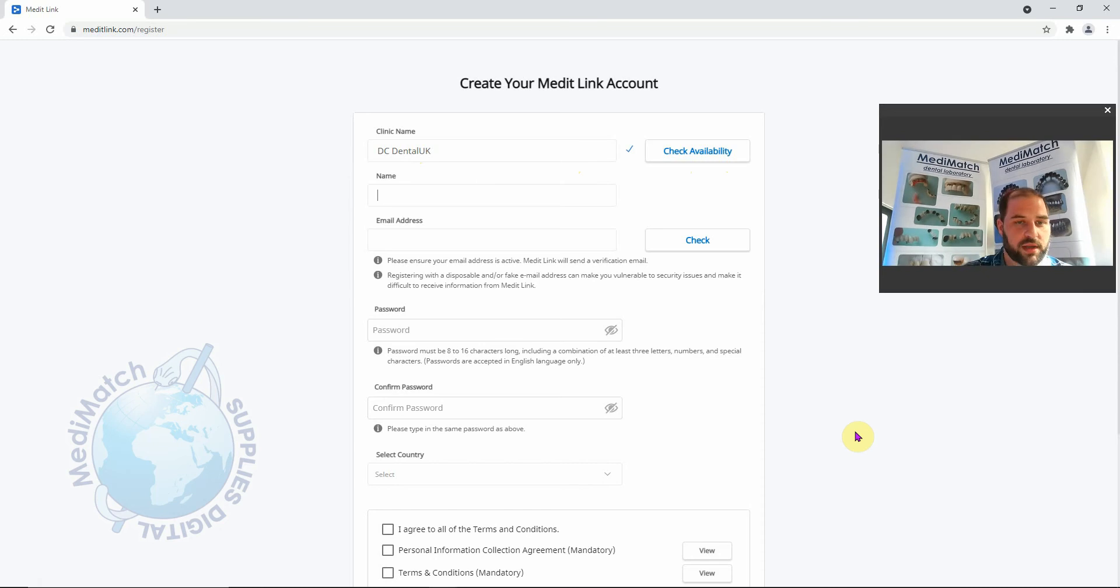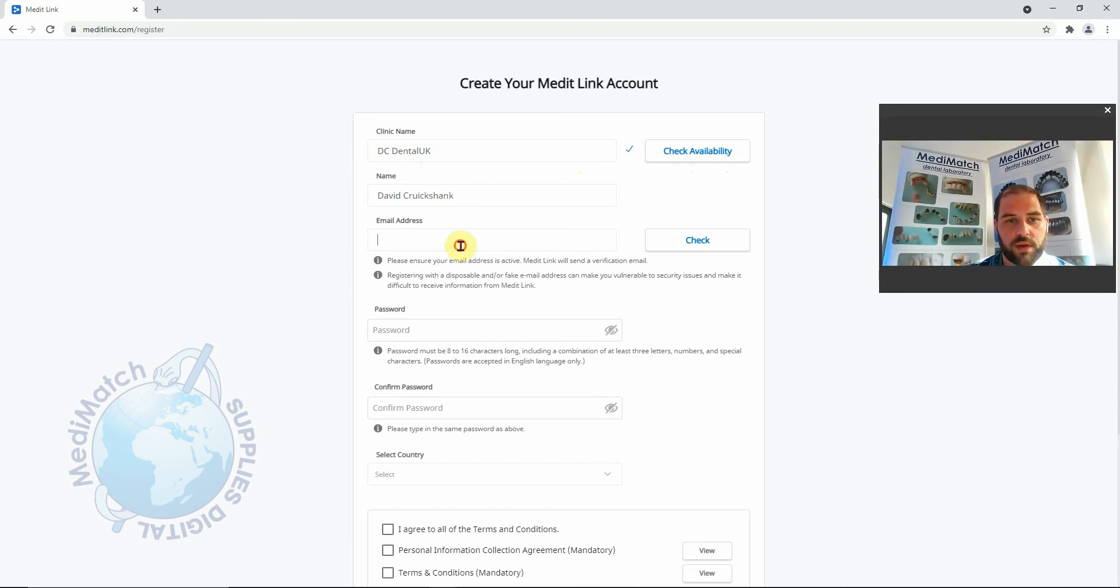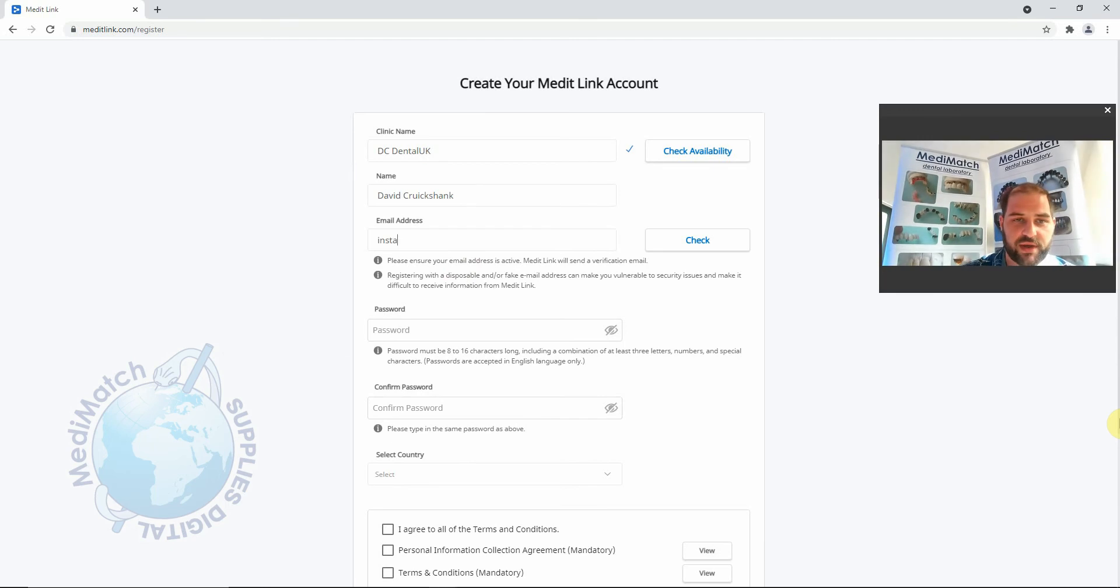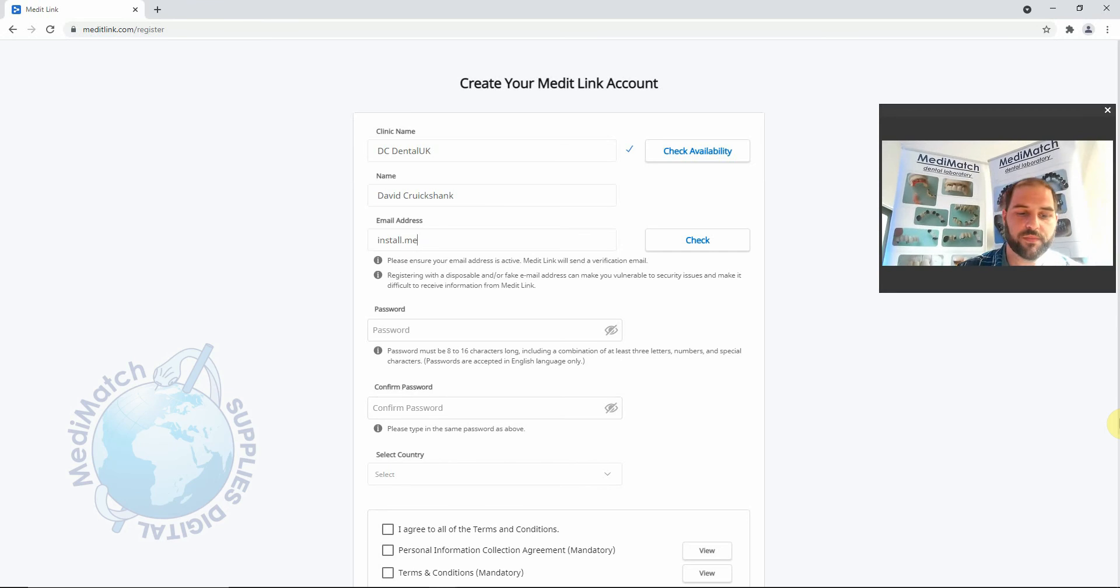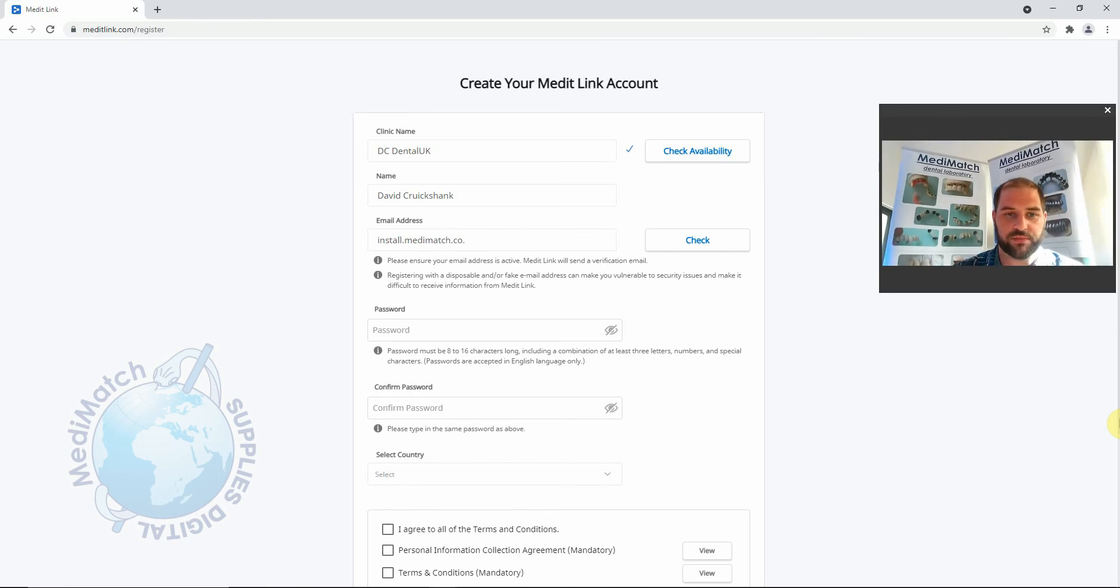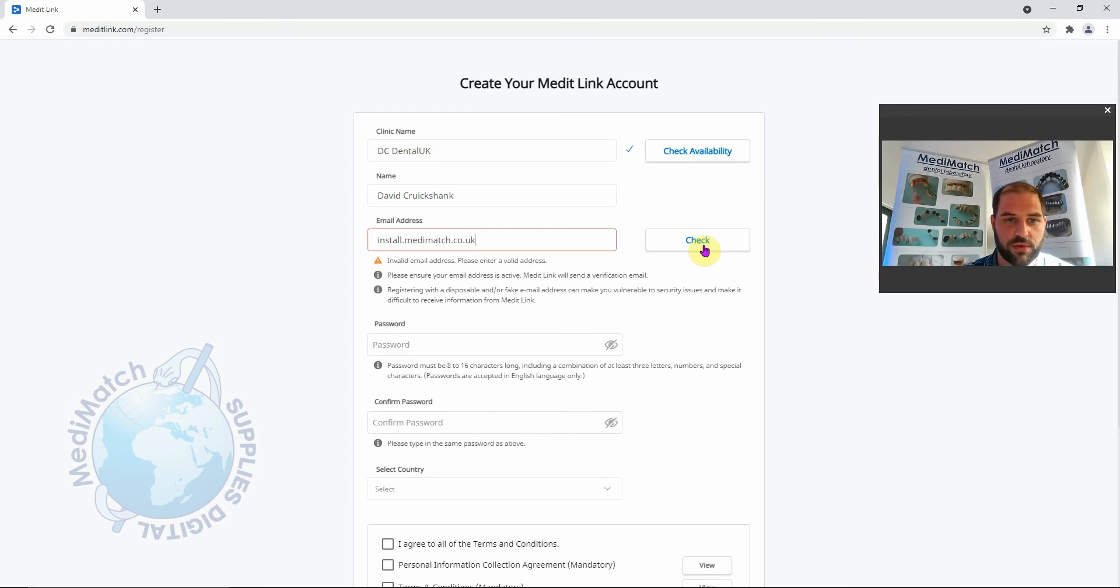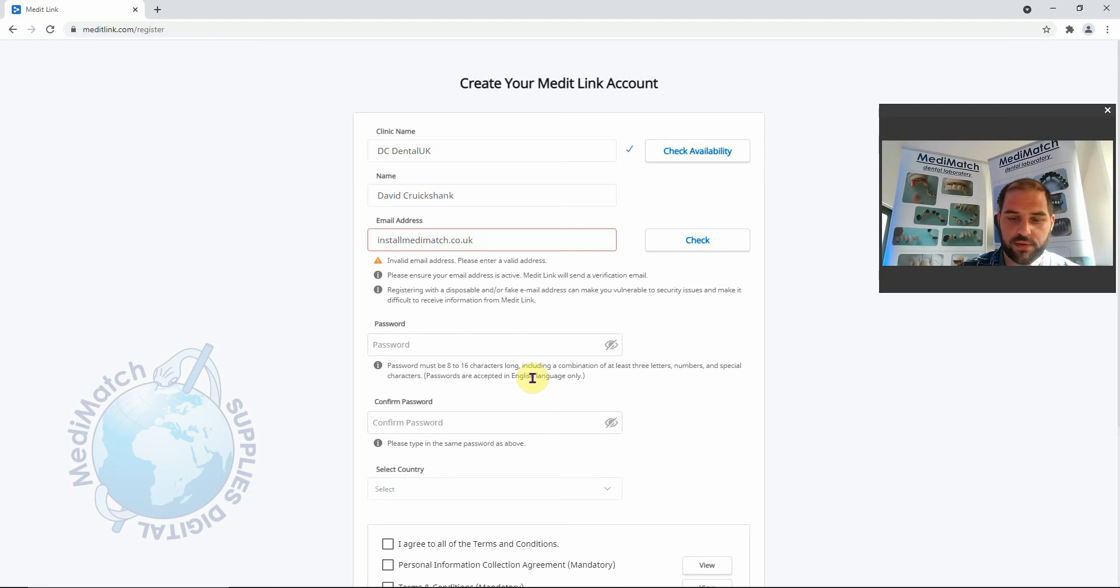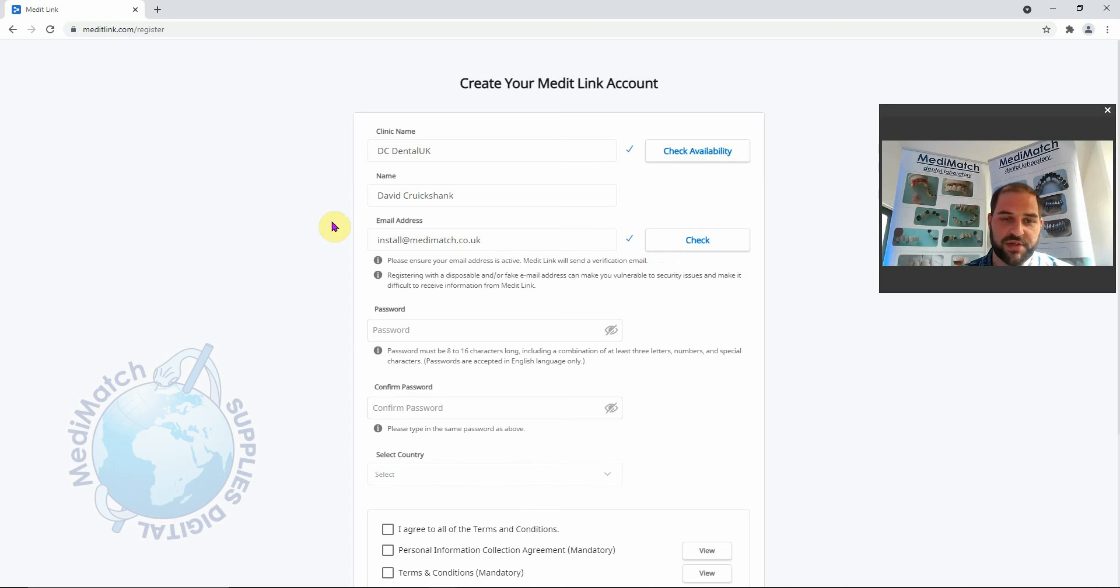I'm going to put my name in. I'm going to put in my email address. Now this email address must be new to the Medit system. It can't have been used elsewhere in any other registration. We need to click check to make sure. Oops, good if I spelt it right. To check that it hasn't been used elsewhere in the Medit system. If it had, it would give you a cross and you'd have to put a different email address in.